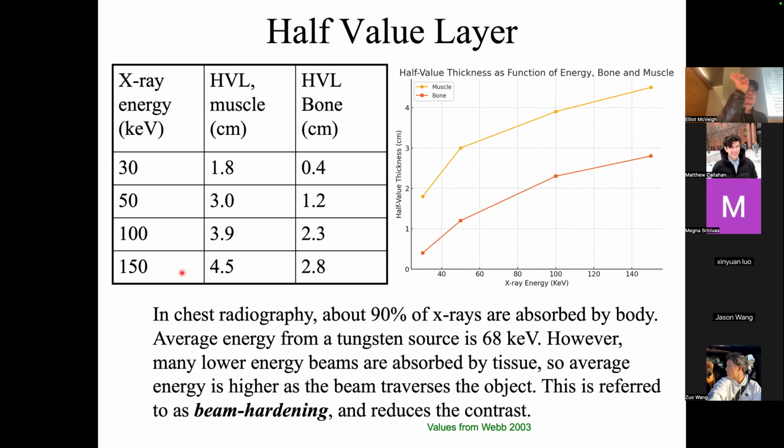So if you have a small little tumor and you want to kill just that tumor, you fire gamma rays at it in a nicely crafted beam that just covers the tumor, and then you shoot it from all different directions, right? So that the pathway in and out doesn't get irradiated much, but the tumor itself gets a lot of radiation. It just all piles up there. And it's usually a big gantry that goes around the patient like this, and you basically kill that tumor with radiation, usually gamma rays.